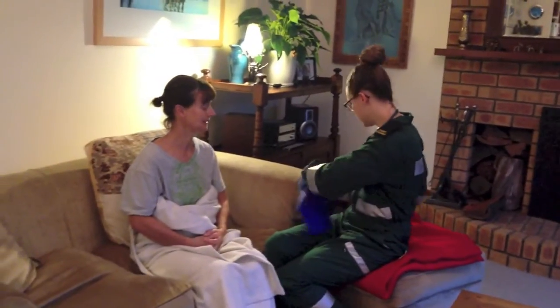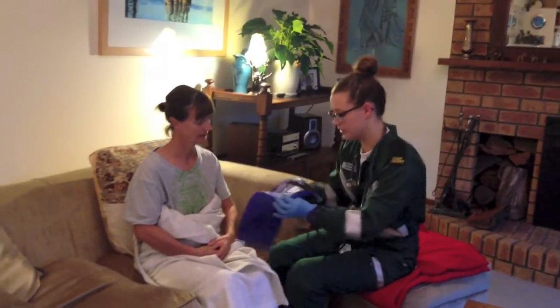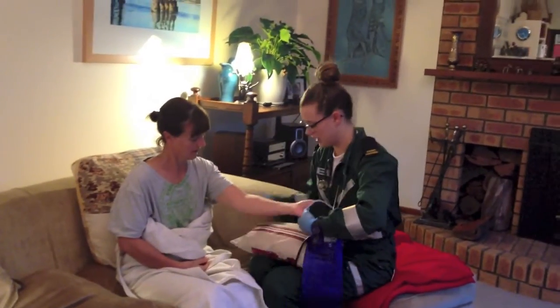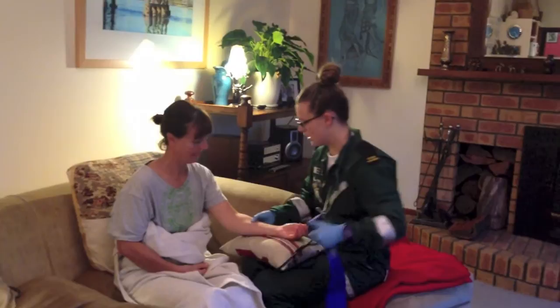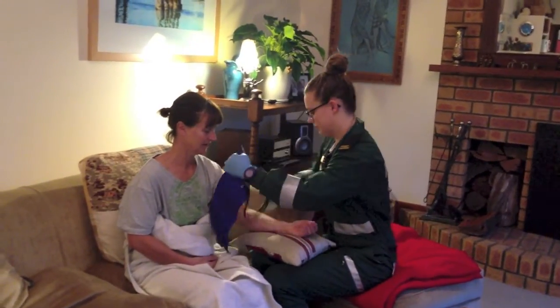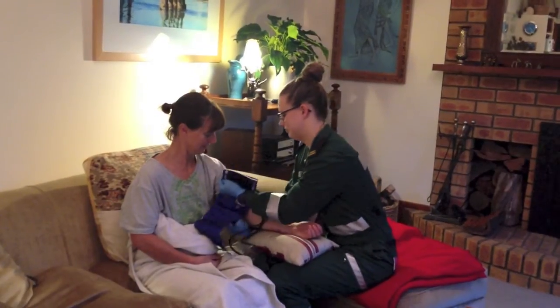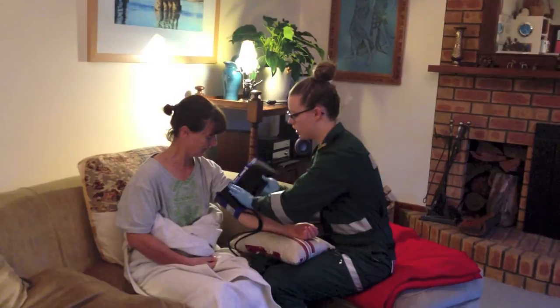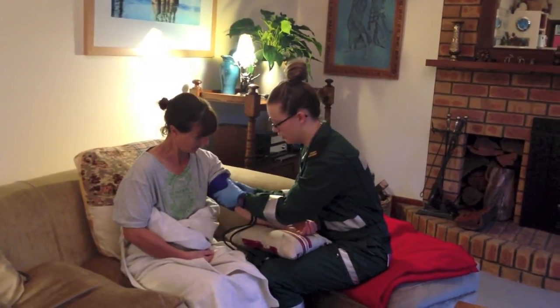Okay. So is it okay if I take your blood pressure today, Mrs. Jones? Yes. Have you had this done before? Yes. Okay, great. So I'll just pop this cuff on you at the moment if I can. Might put your hand on this cushion again to keep it comfortable. Is that relaxed for you? Thank you. Okay, great. So I'll just put this on you. Now when I'm inflating the cuff, it could get a little bit tight, but that shouldn't last for too long.